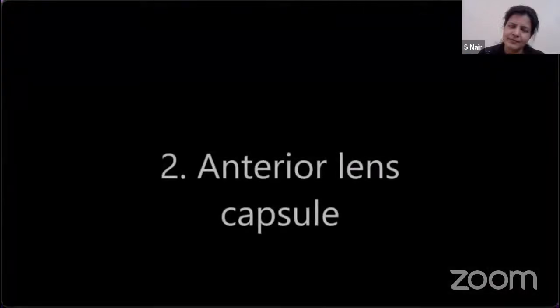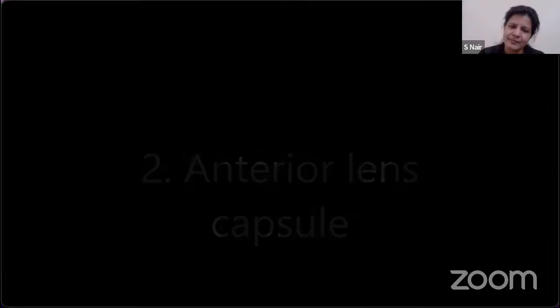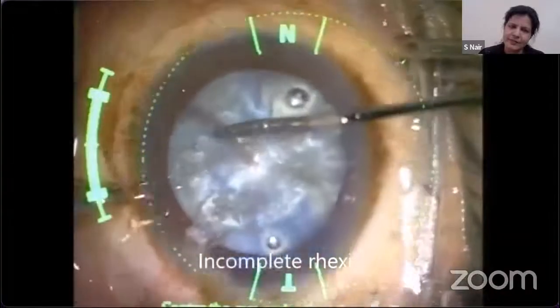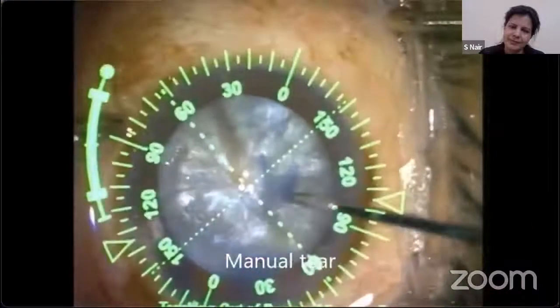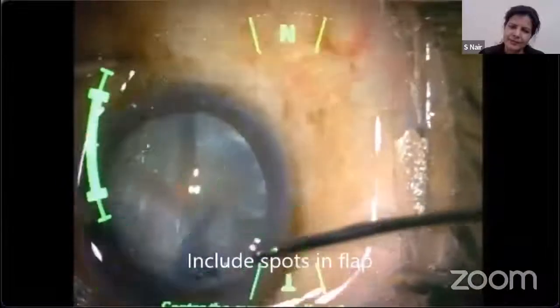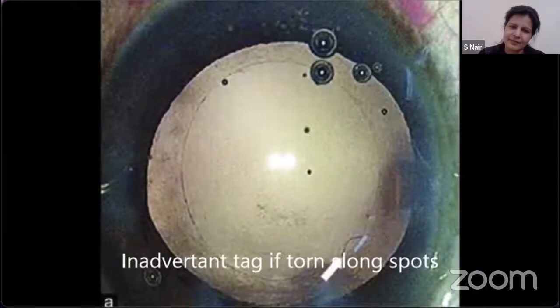in this case. The anterior lens capsule is the next membrane encountered. Most femtorhexis are free-floating. Some may be tethered to the capsule at points. Such incomplete rhexis need to be manually completed, including all the laser spots in the flap to be pulled out along with the outgoing flap. Non-adherence to this tenet can lead to ALC tags that can go onto PCRs.